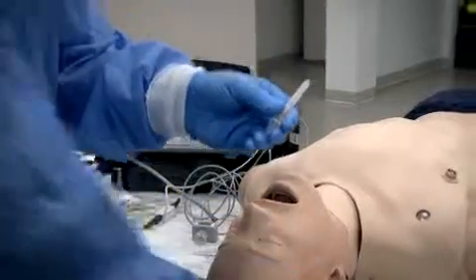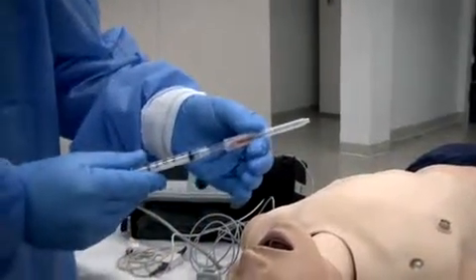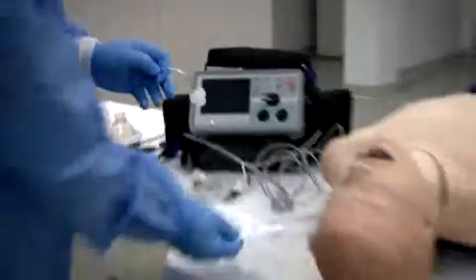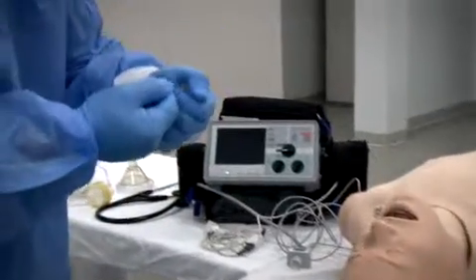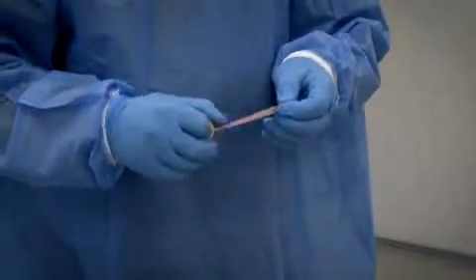Attach the syringe to the catheter. Open the ETT and remove its 15 millimeter adapter and reserve it for later to attach to the IV catheter. Lastly, prepare the tape that will be used to secure the catheter in place.